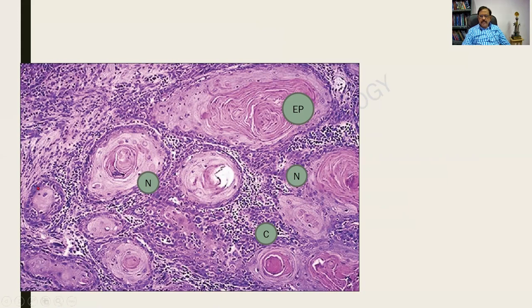As more and more secretions are deposited, they harden into a beautiful jewel which you buy and wear. I said it is in the form of nests over here. Sometimes you find that they can be long cord-like structures. And this is the supporting stroma, where all the blue dots are inflammatory lymphocytes.